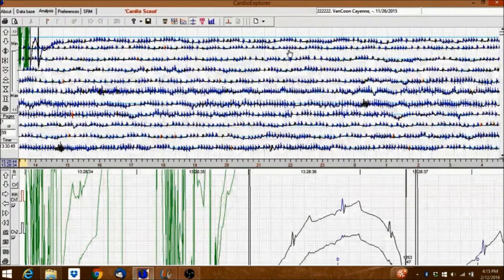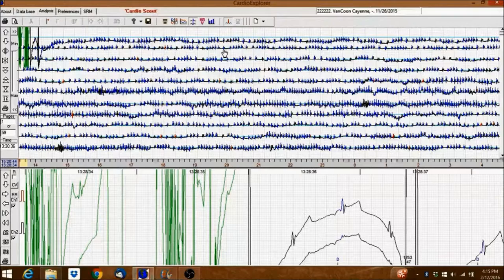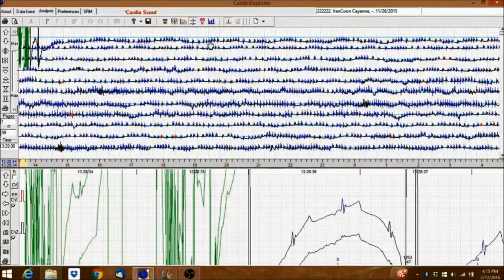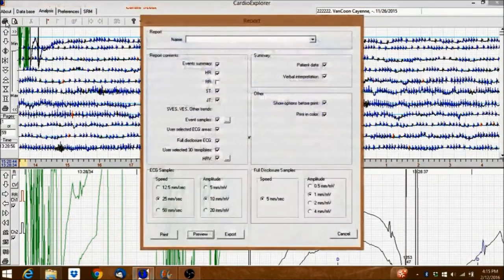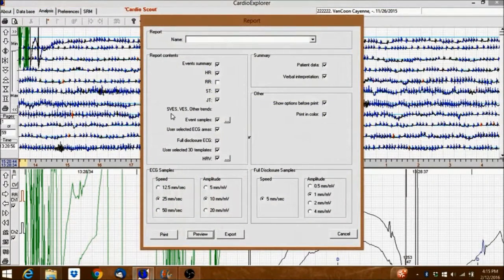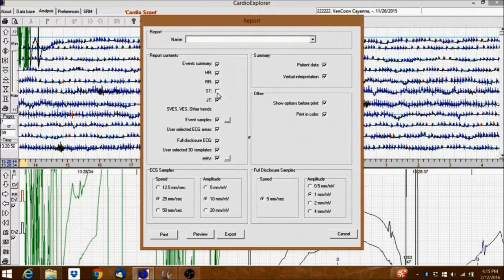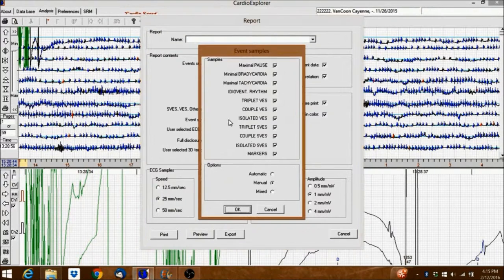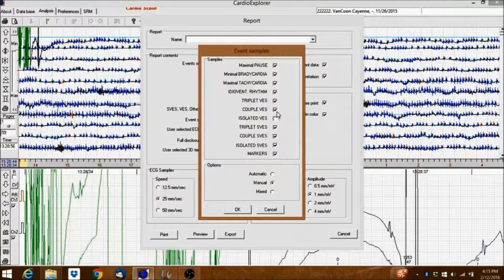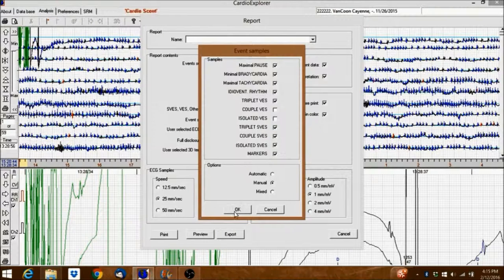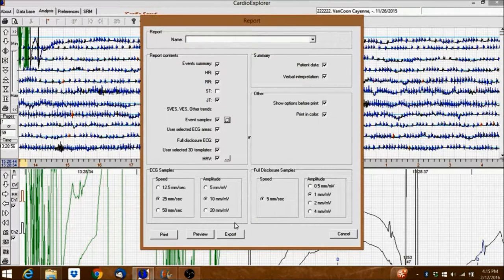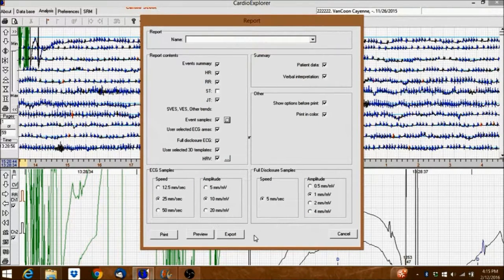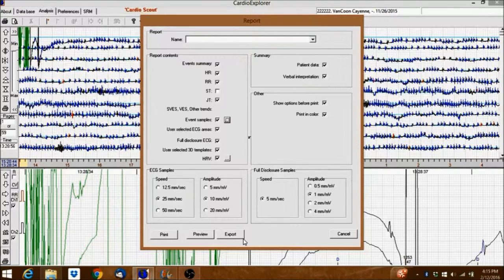To create a report, click on the Report Generator button. Here you can choose which event samples you want included in the report. You can choose to preview the report, print the report, or export the report. Let's preview the report now.